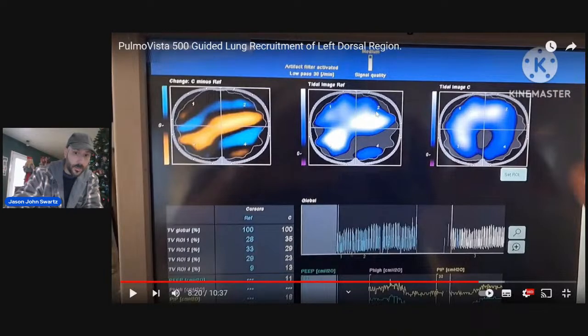The white is more intense here, less here. So the tidal volume that's being pushed in, this area is actually receiving the largest amount. So when you have an atelectatic area here, putting this at risk, and on top of it, it's receiving the most volume, this is not a good pattern of distribution. It's a distribution pattern that's going to lead to lung injury.